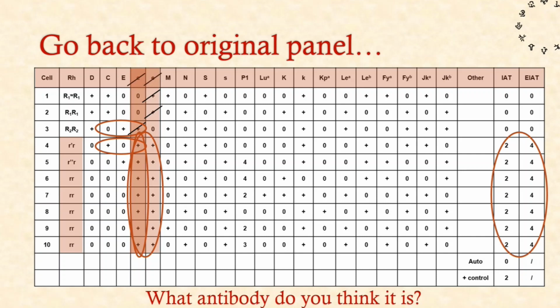What is it? So then you look at all of these antigens. You know from the previous one that you've excluded the presence of any other antibodies apart from what looks like a little c. So this is where you've got to think, well, it's obviously something that isn't listed here, because when you're making panels, you can't account for every combination because there are so many antibodies out there. Your sheets would just be pages and pages and pages, and would take hours to do that.